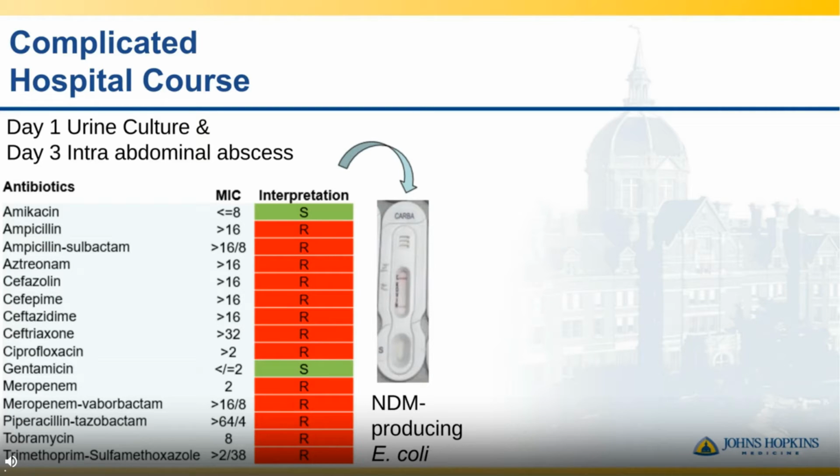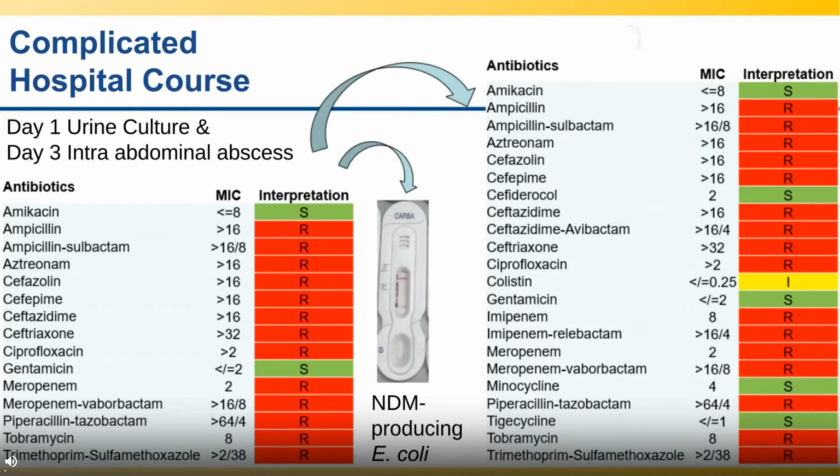When we see these complex or multi-drug resistant phenotypes in the lab, we then start to release additional agents or cascade report additional agents on our panels, as well as set up additional antimicrobial susceptibility testing to try to guide therapy. And in this case, this isolate was also resistant to the novel β-lactam, β-lactamase inhibitors like ceftazidime-avibactam, meropenem-vaborbactam, and imipenem-relebactam, all consistent with this being an NDM-producing E. coli.